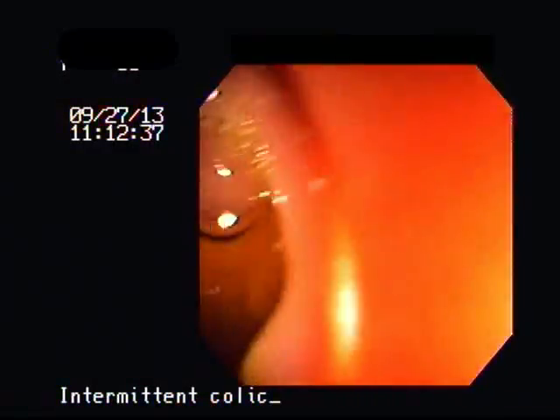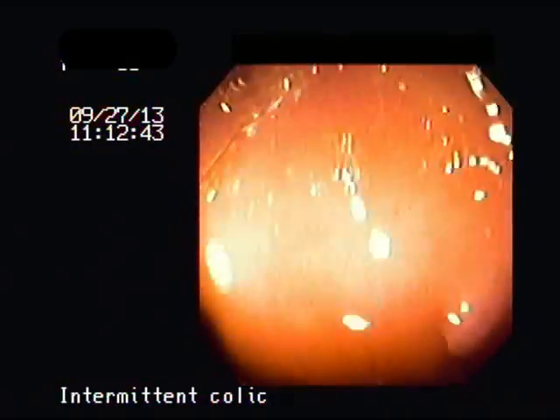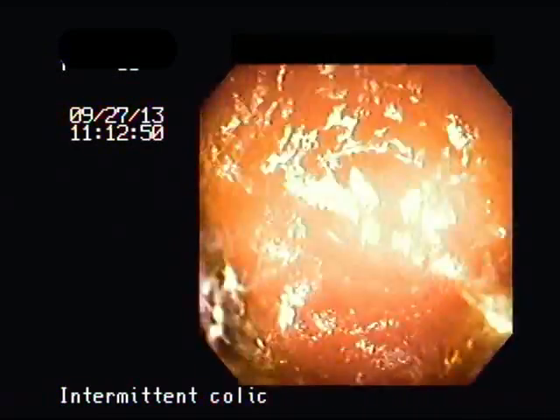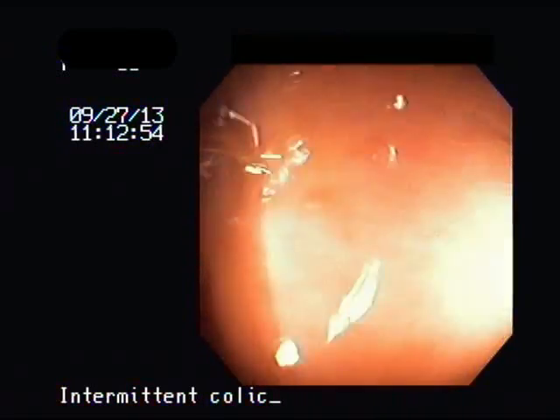This fluid that is coming into view is the bile which the liver secretes to help with digestion. It comes out through the duodenal papilla, which is that little knobbing that we can see on the screen right there. It is important to examine this area as some ulcers tend to occur in this location.